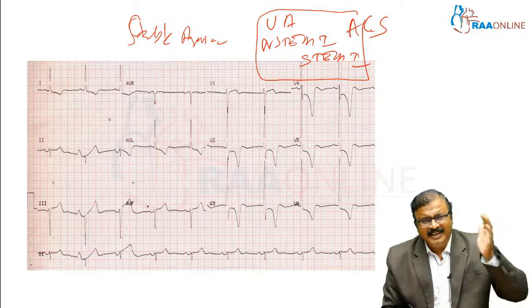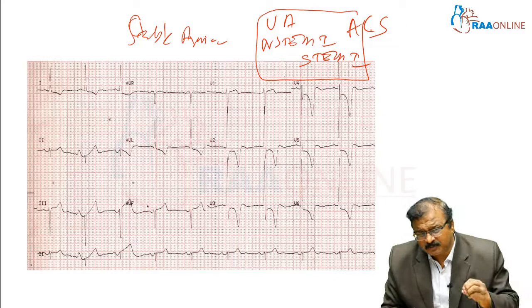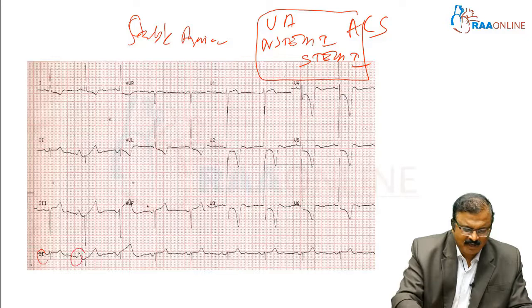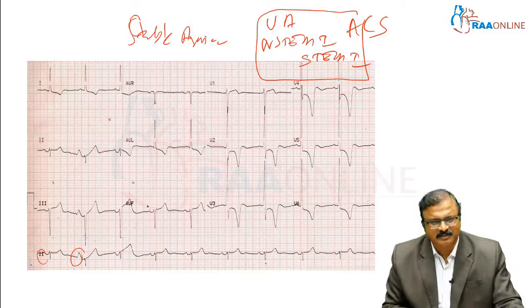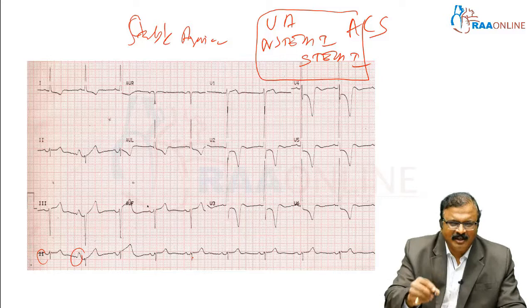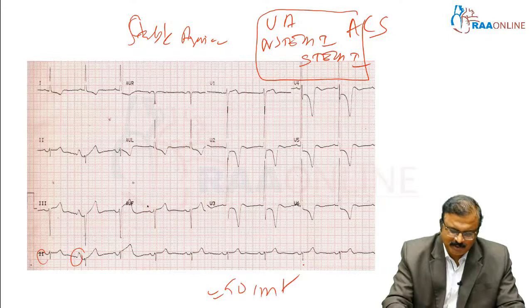When interpreting any ECG, always start as a beginner. Look at the rhythm first — check whether there are P waves, whether all P waves are followed by QRS complexes, and whether the RR interval is regular. Here, P is normal, QRS is normal duration, RR is regular, and the heart rate is approximately 60 per minute.